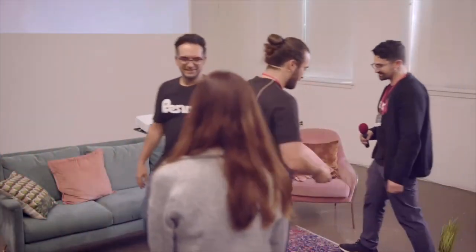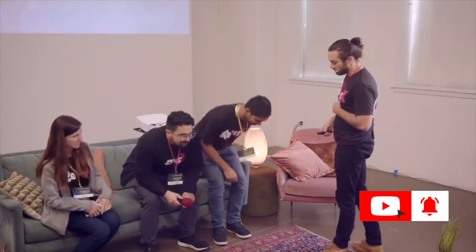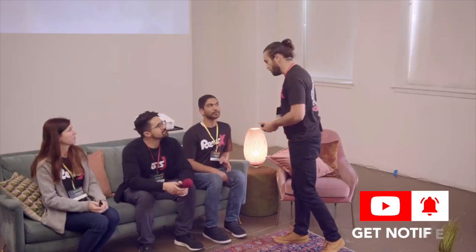It's the same concept as last time. We have 3 video airways to review. We're going to tackle them as a group. So as you guys start to interpret the video, just feel free to chime in. We're going to start with some of the basics. What are we even looking at?